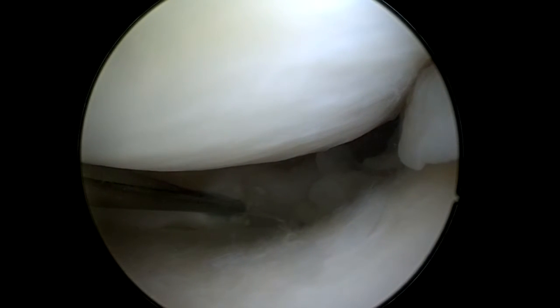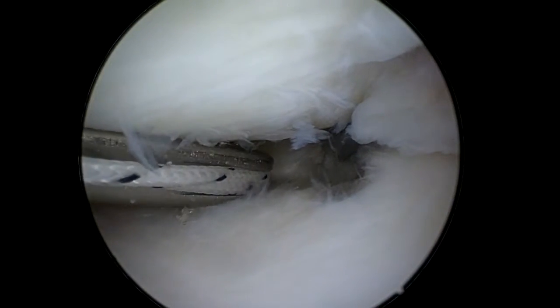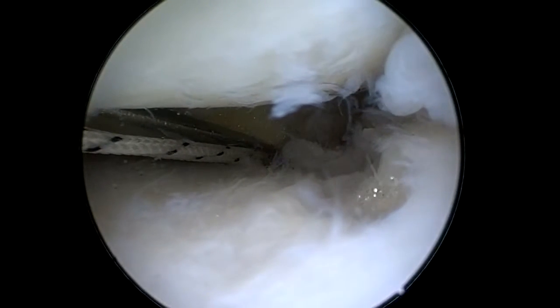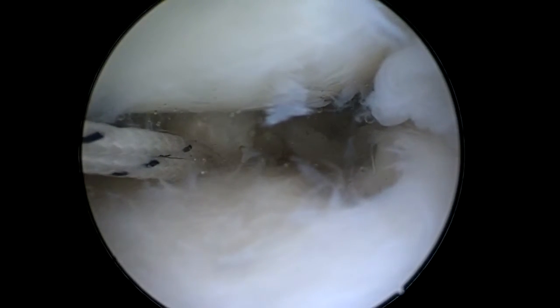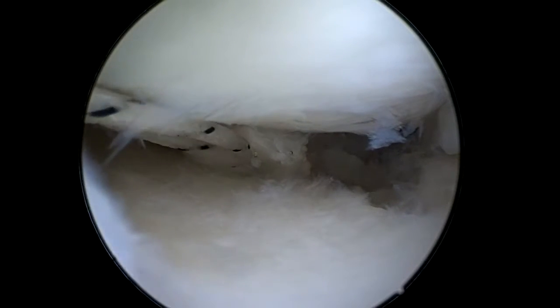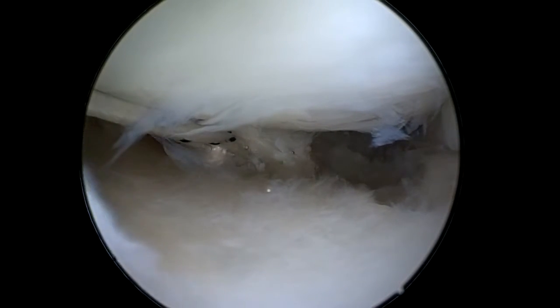After I have, as we call it, avivered the local wound area, I put with a special device a suture loop through one end of the meniscus. I make a loop so that I can make a knot and tie the suture through the meniscus to the meniscus end, as you can see here.